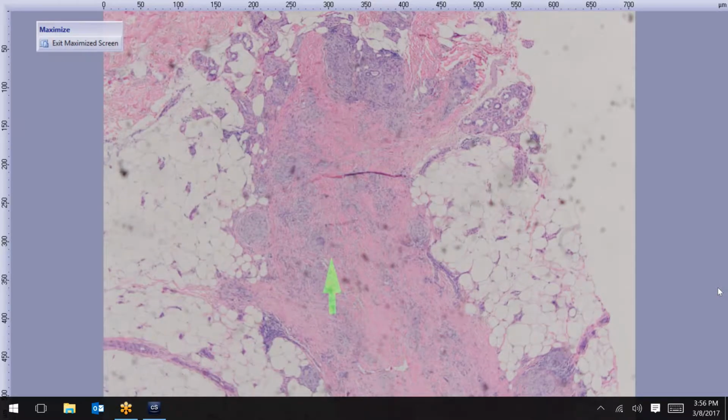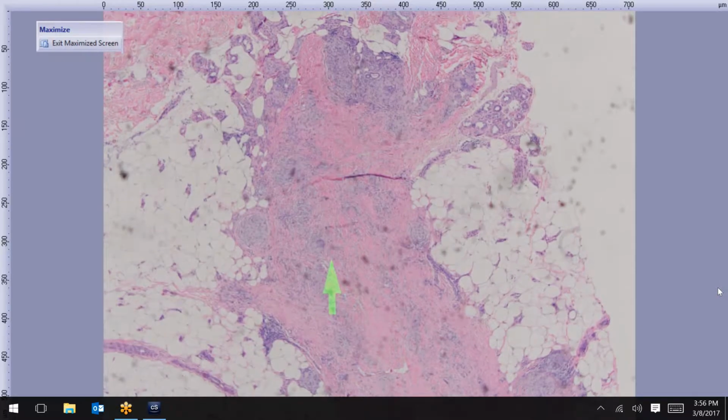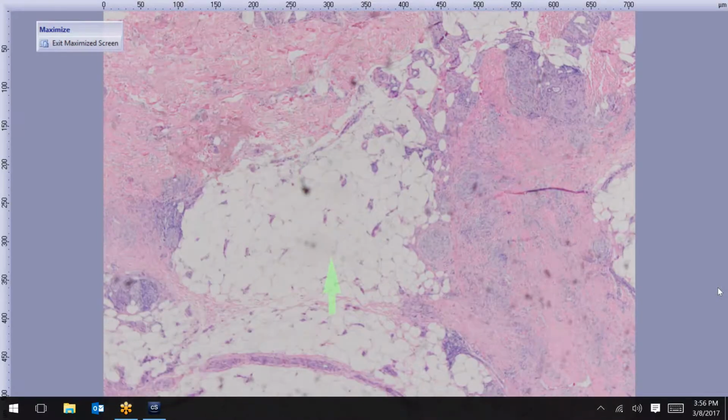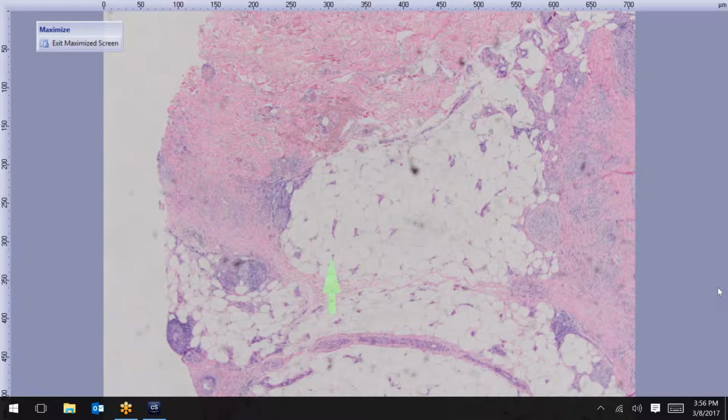And you can see that there's inflammation and septal thickening. And I would say for the purposes of you guys in terms of board exams or testing, there's not much else that is going to be on your differential for panniculitis. It's going to give you this kind of septal thickening and septal panniculitis. And so this is erythema nodosum.